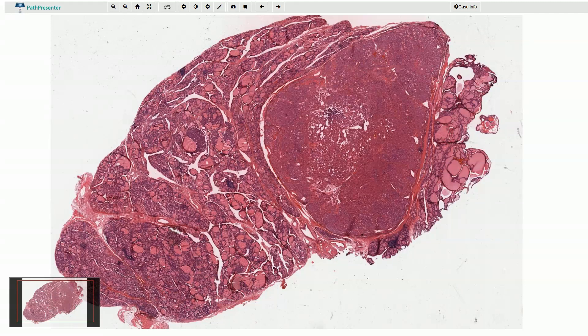Hyalinizing trabecular tumor of the thyroid gland is a specific neoplasm of follicular derivation which shows quite prominent trabecular architecture and also variable intra-trabecular hyalinization.